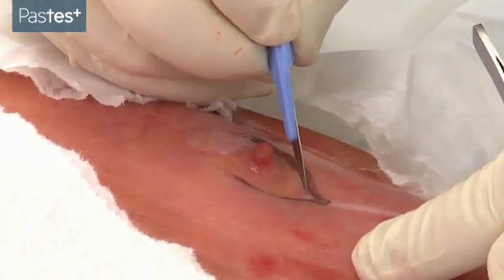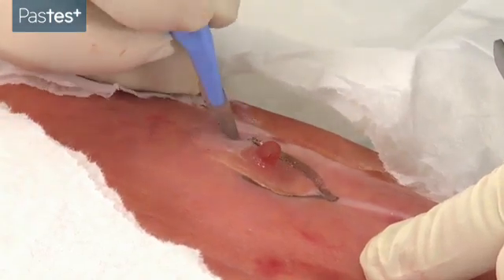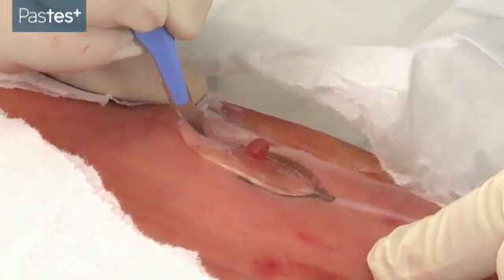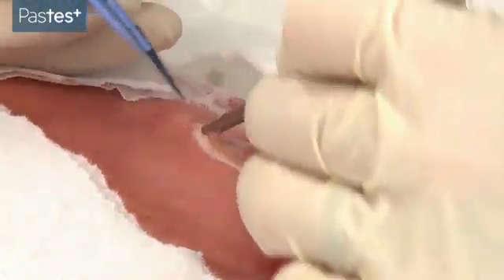Think about the layers you're going through as you make your incision. You don't want to go too deep or too shallow, but you do need to make sure that you get the whole lesion. Once you've made your incision, you can then begin to remove the lesion.